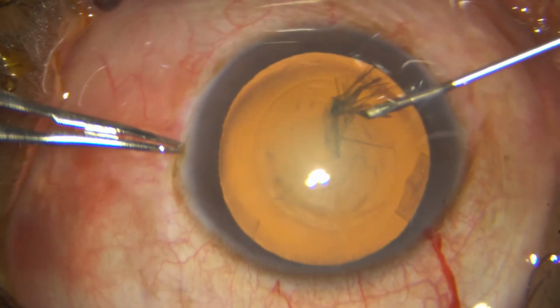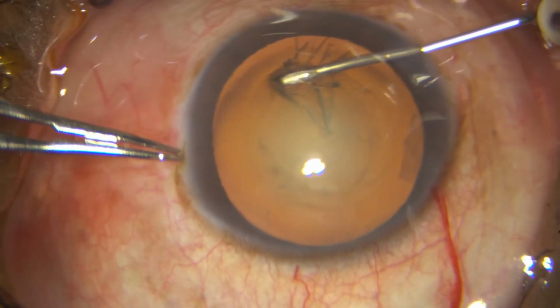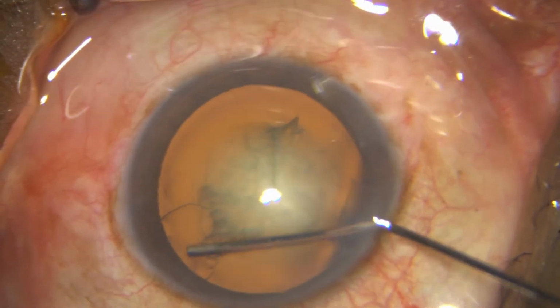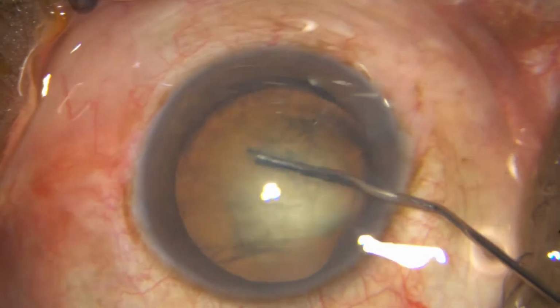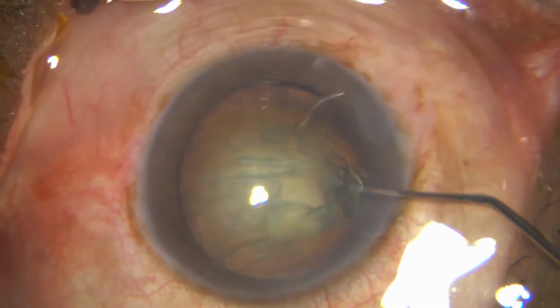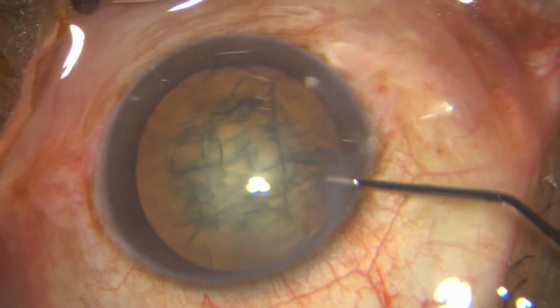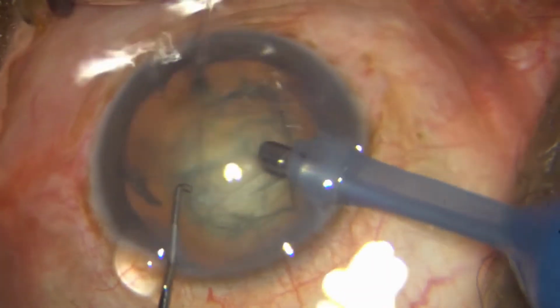And that's a pretty good rhexis. Once that's done, I go ahead and first decompress the chamber and then do your hydrodissection. That's a good fluid wave. Decompress and rotate the nucleus with the tip of your hydrodissection cannula itself. It's good. No need to keep on hydrodissecting all over the place and landing up in other complications.